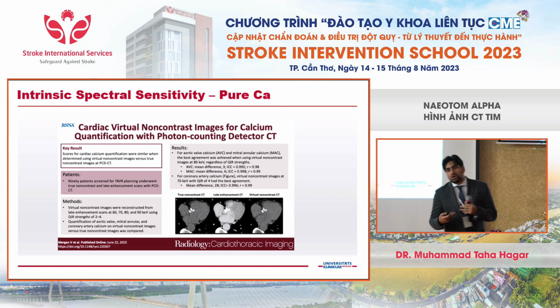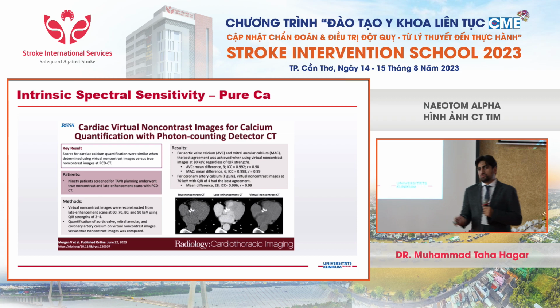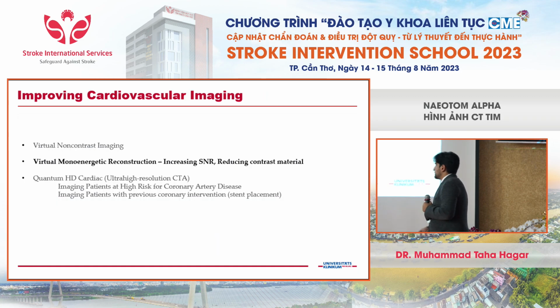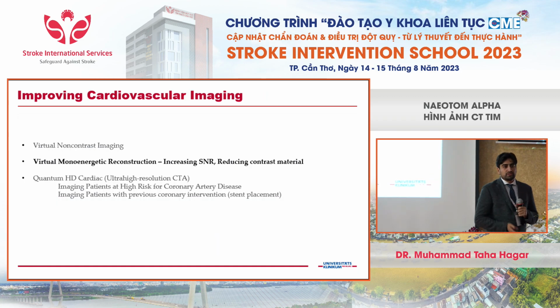And when you think about it, this has major possibilities for the future, where you could employ calcium scoring in post-contrast thoracic images where you stage your patient, and then you can assess their risk factors not only in true non-contrast cardiac CT. Also maybe in the future this can be performed automatically or with AI. So, one major advancement of this technology.